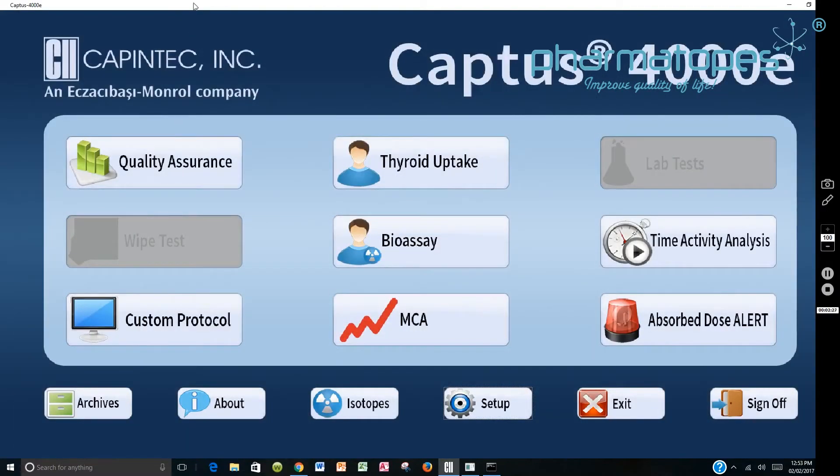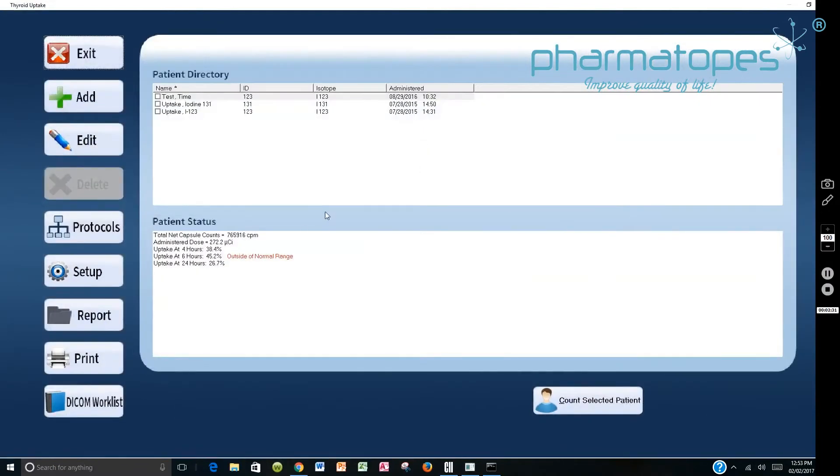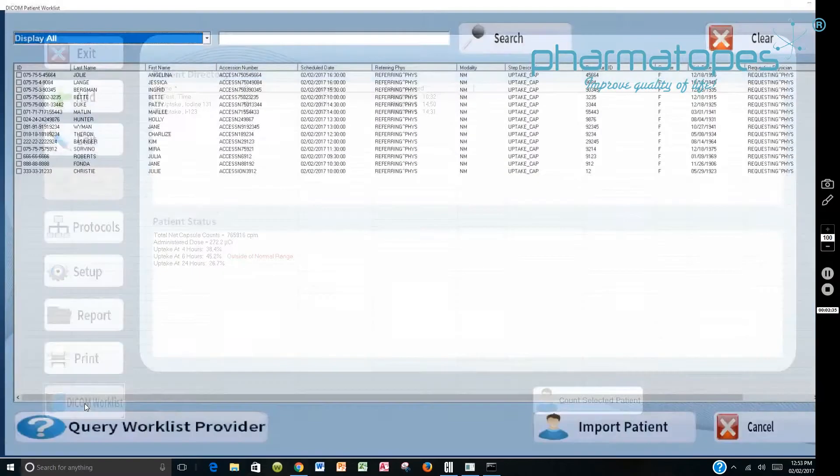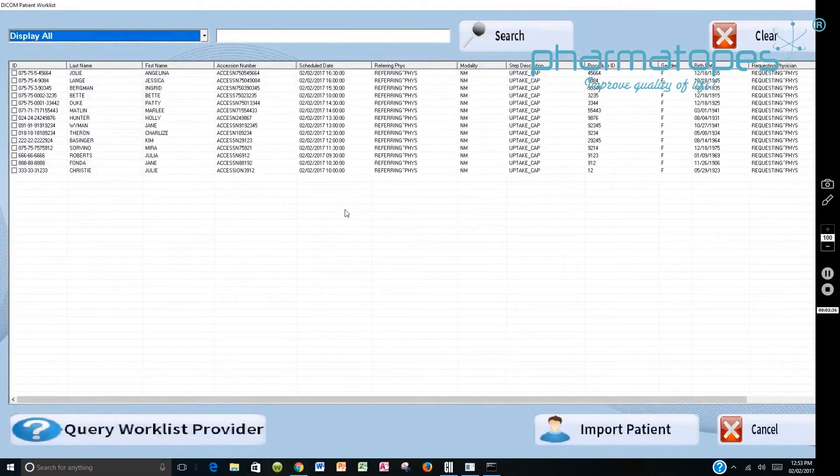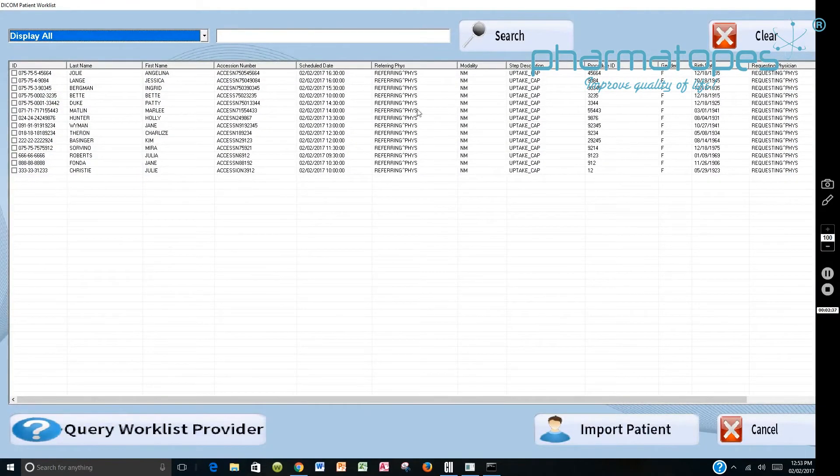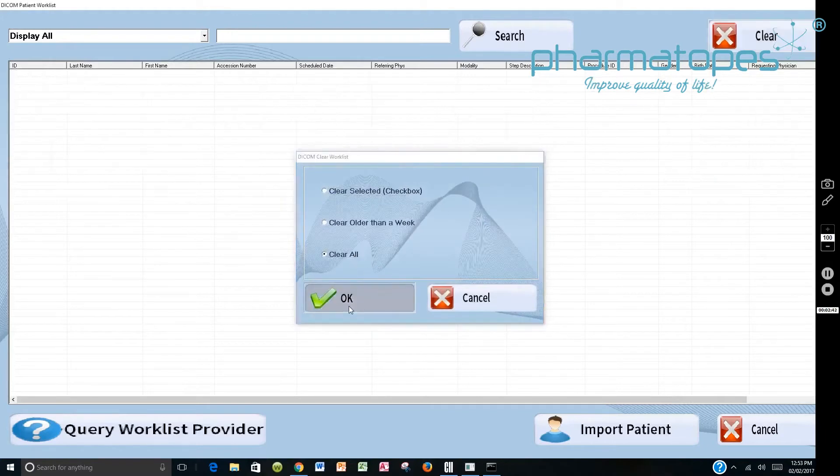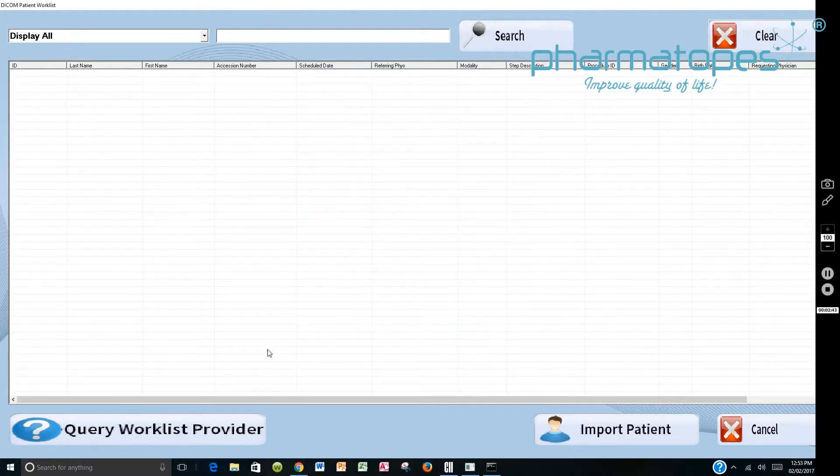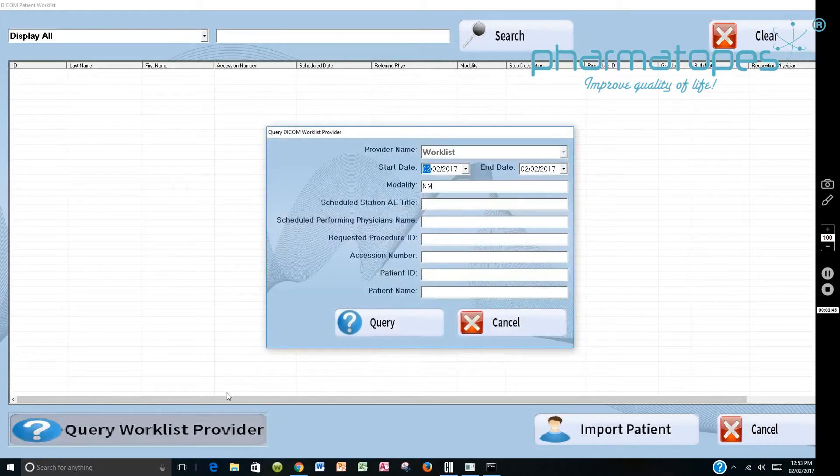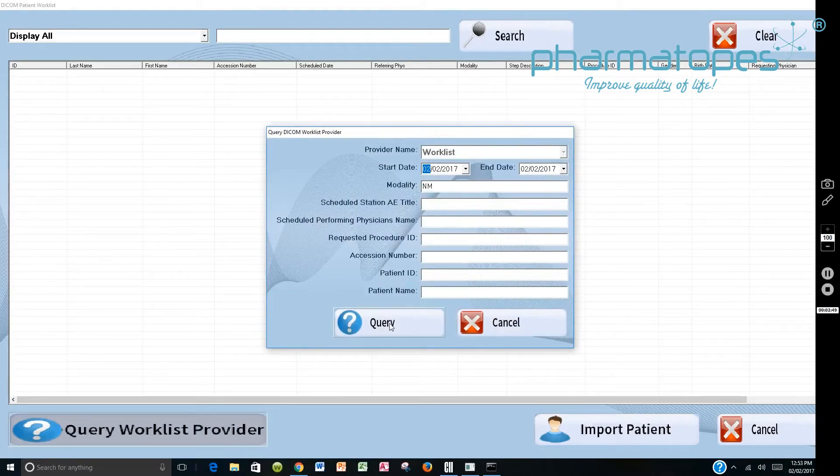To do the thyroid uptakes, we would say Thyroid Uptake. It brings this up. We want to then go to a DICOM Worklist. It pulls this up. If there's DICOM data on it, we would clear all of that data by going to Clear All and selecting OK. Then we would query the Worklist Provider, and it would query it by the day's date and the modality nuclear medicine. We would query it.